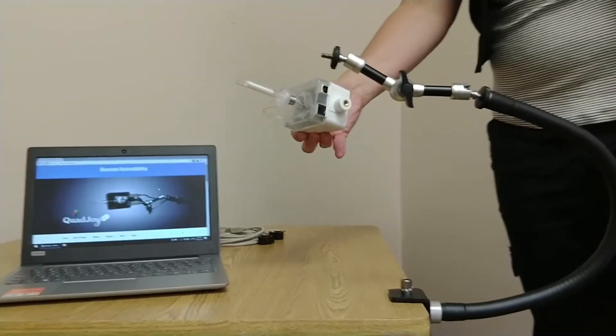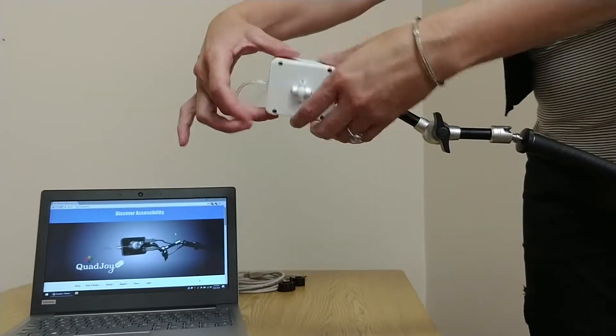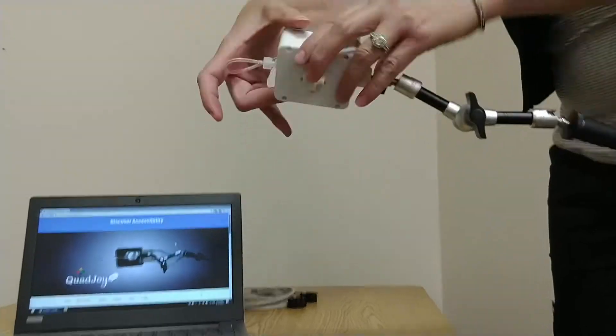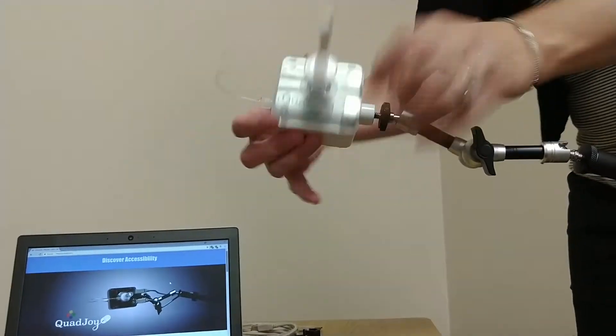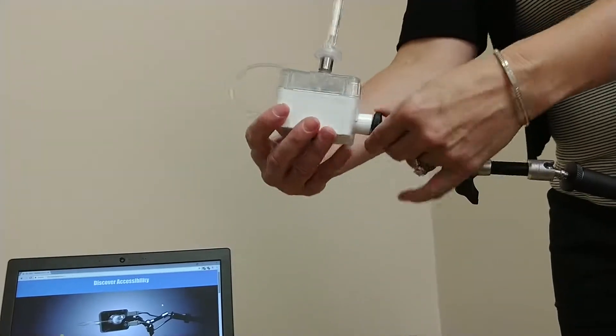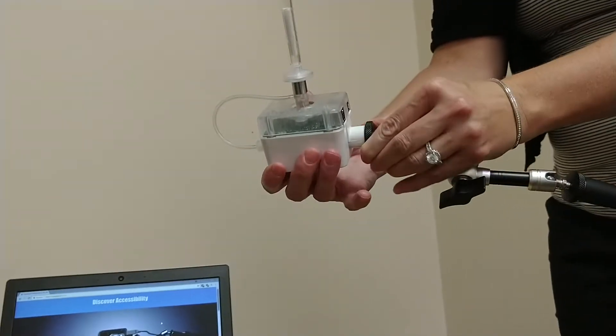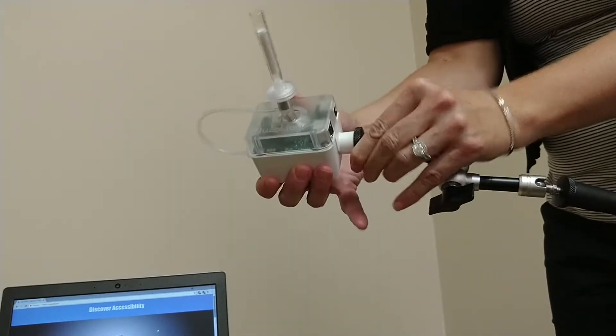Now take your Quad Joy and thread it onto the articulating end. Lastly, you'll want to tighten that black ring a few small turns to lock the Quad Joy in place.